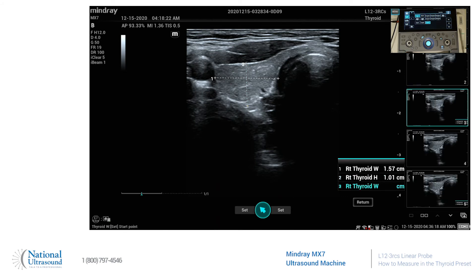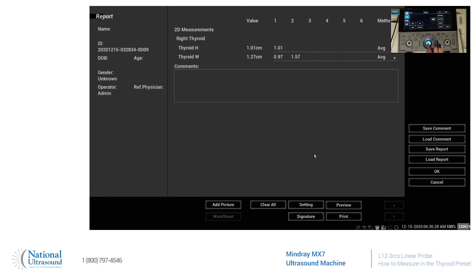To bring up all of your calculations to see in the report, slide over to get to our main menu, hit report, and then the calculations will be in here. If you needed to delete one, you're going to scroll over and hit the backspace.